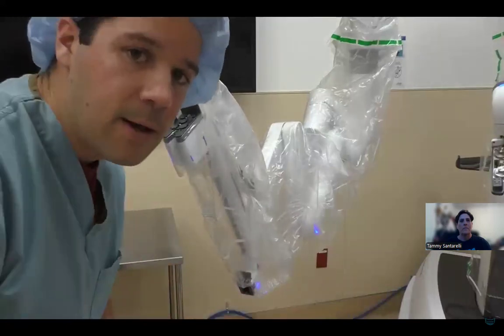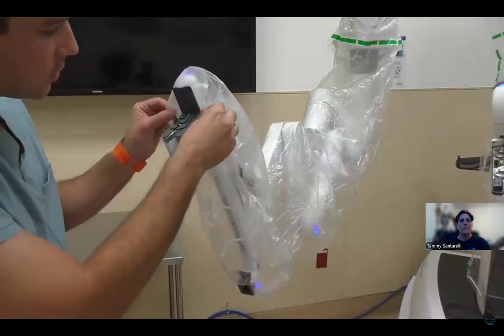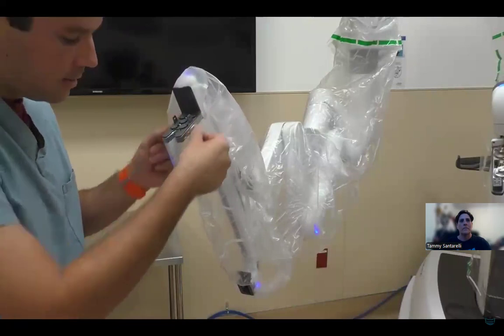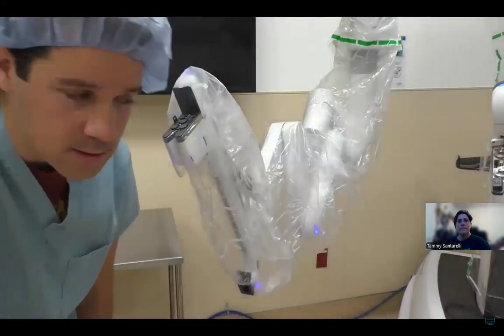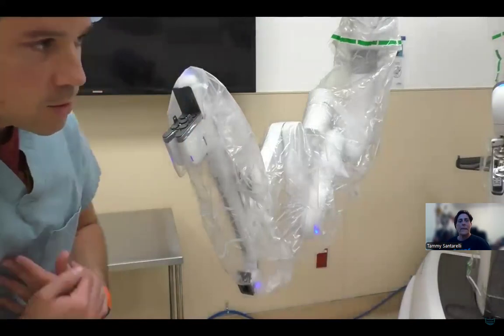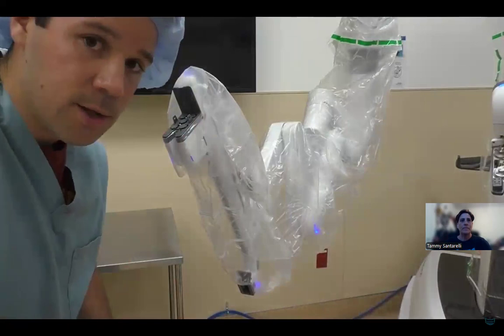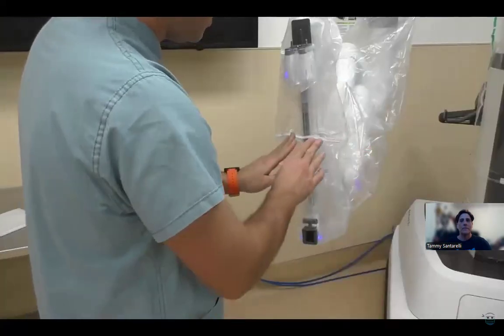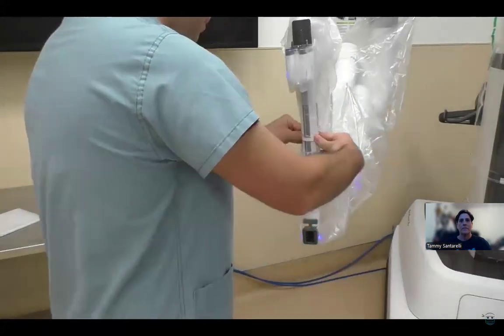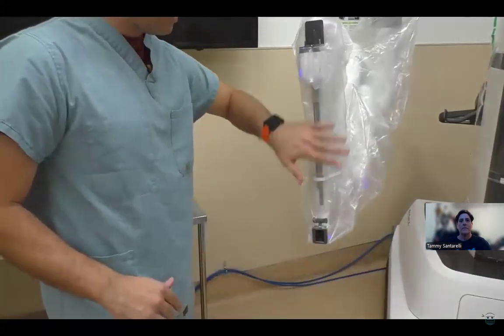It's very, very important to note that you do not get any excess drapes underneath these plastic pieces. If you do, you'll probably have a fault. It won't dock right. It won't accept an instrument correctly. It's just not good. I will take these little malleable things and I will just press them backwards to keep this drape smooth and out of the way.